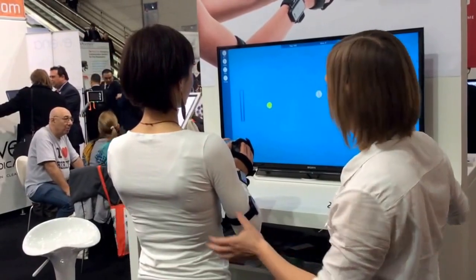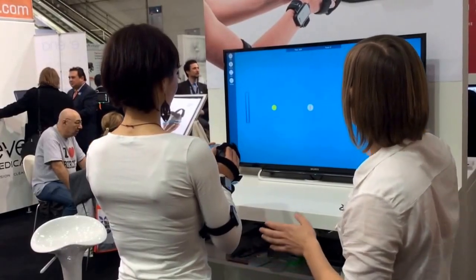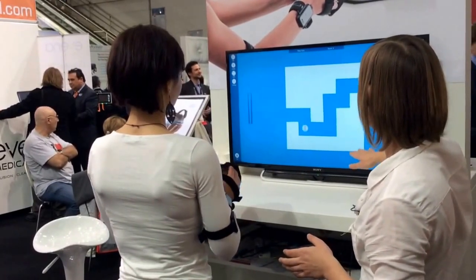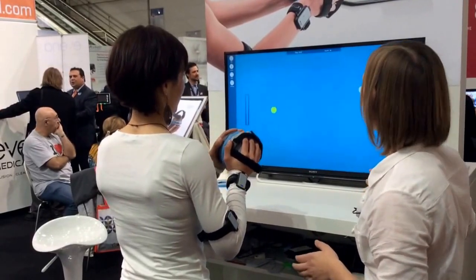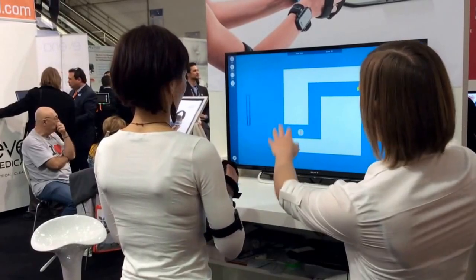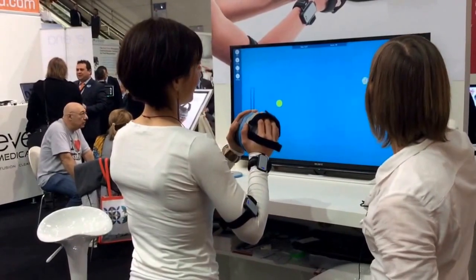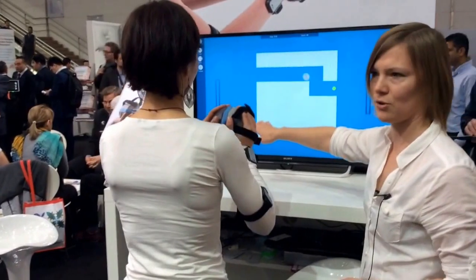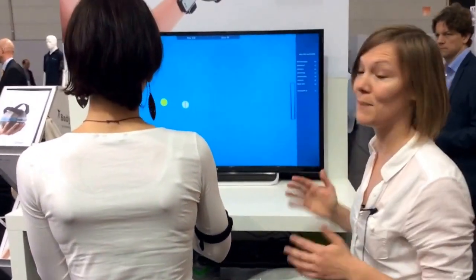Step back so you don't hit yourself — exactly like that. I put you in the central position; just go and get the green point. Navigate to the other side of the labyrinth without touching the walls. If the patient does more work with the affected arm, a green bar shows. If the patient does more work with the healthy arm, a red bar shows.